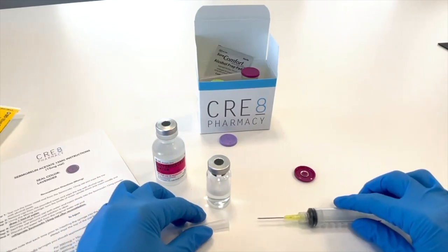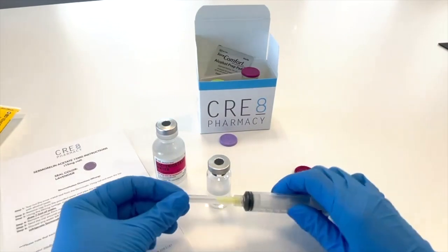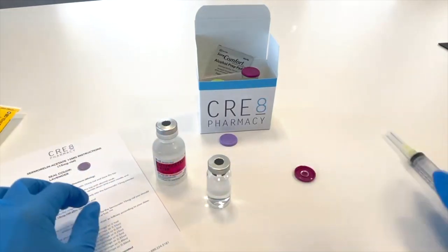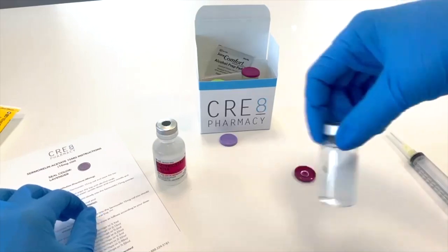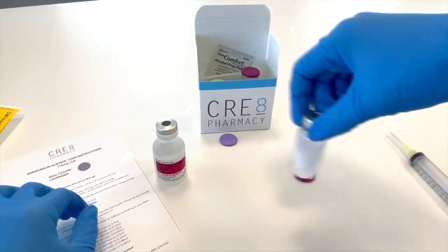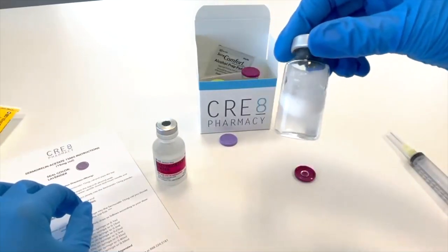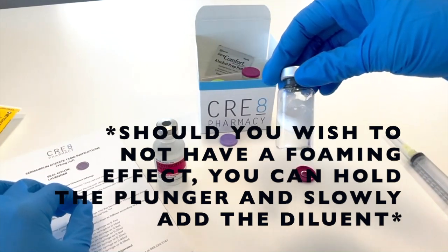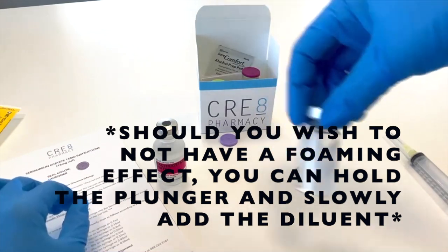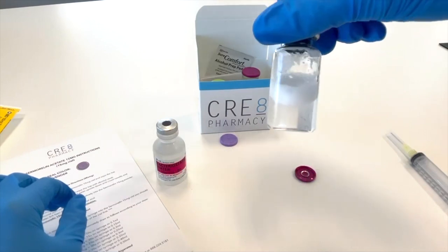Lastly, carefully recap your mixing syringe and properly discard. Before injecting, give the vial a few swirls to ensure that all of the powder is now in its liquid form. Once the bubbles have subsided, you are now ready to inject.